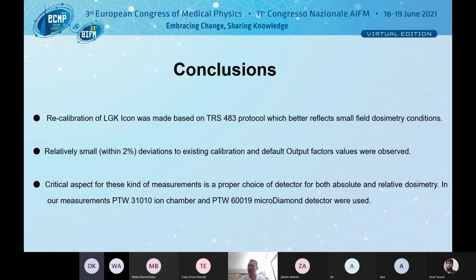In many systems, of course, you typically measure your own factors, but for gamma knife they come as a default, and those measurements proved we are very close and consistent. So we didn't change, not even 1.5% or less than 1%. We kept Elekta numbers, and again, as much as I know, most users follow this approach, keeping those default values, because it also brings consistency in the treatment, especially for functional treatments.